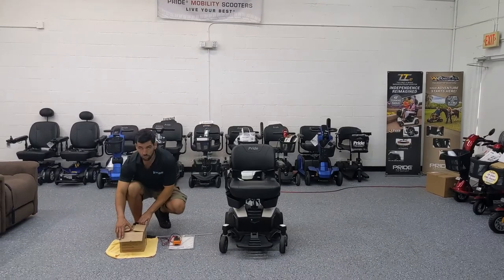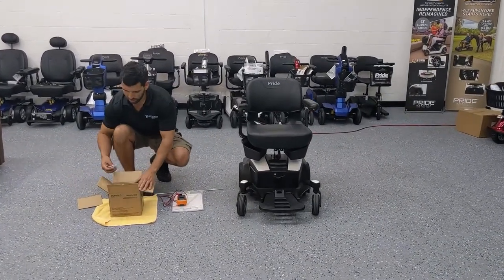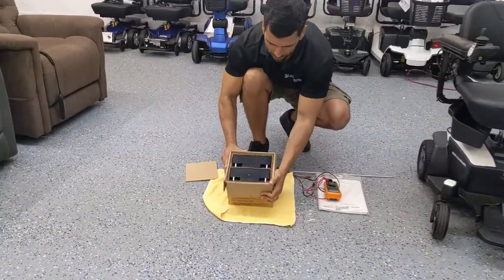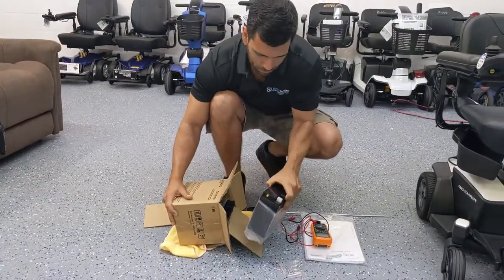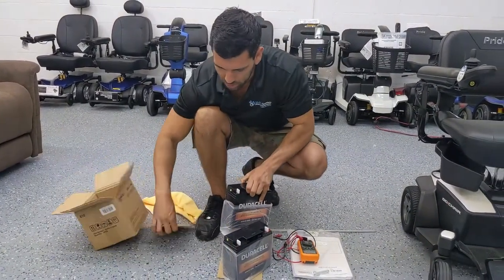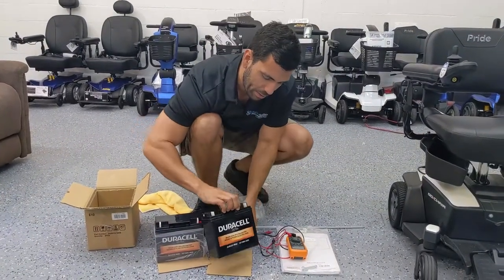You're going to want to have replacement new batteries ready to go. These are brand new 12-volt 18 amp hour batteries, which is what this particular power wheelchair requires as a replacement.